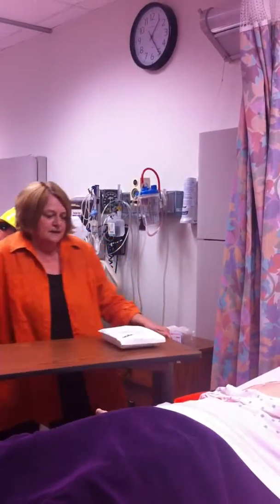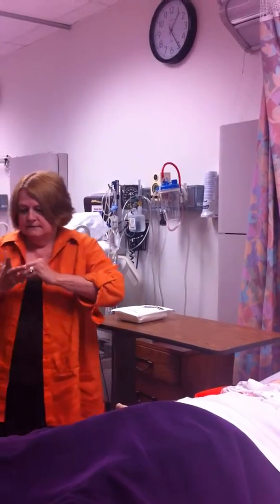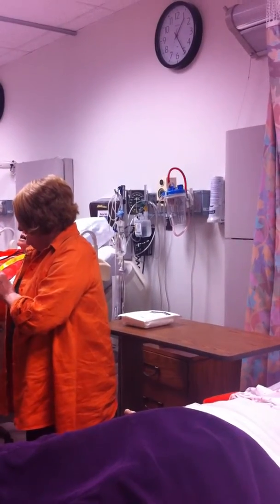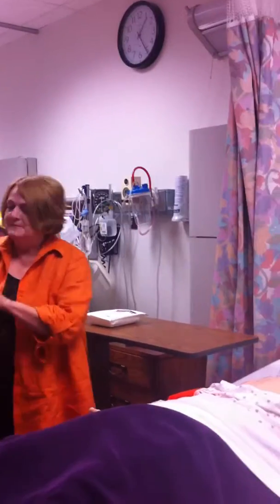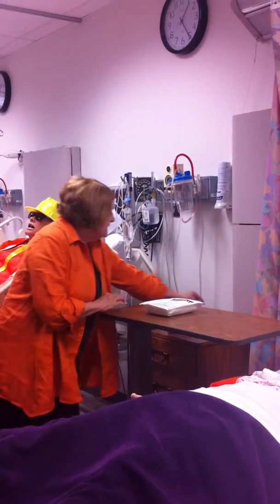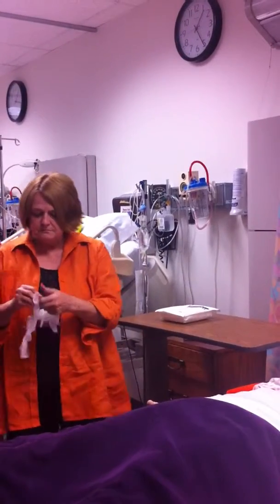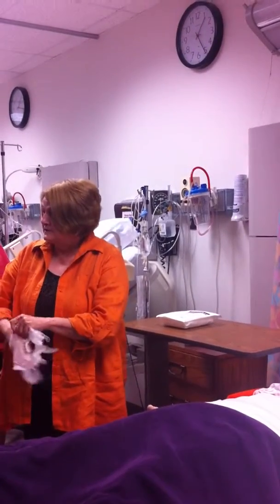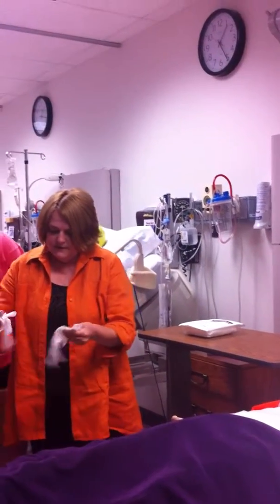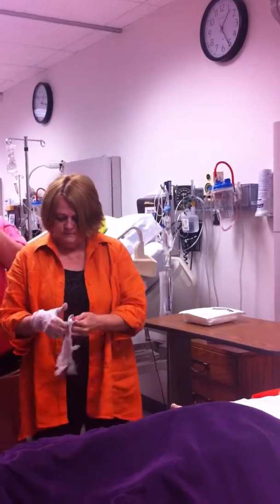Okay. I have washed my hands, taken off my jewelry. Well, he doesn't have a dressing on. If he had a dressing on, I would put on clean gloves, and I would remove the old dressing. And I would do that slowly.